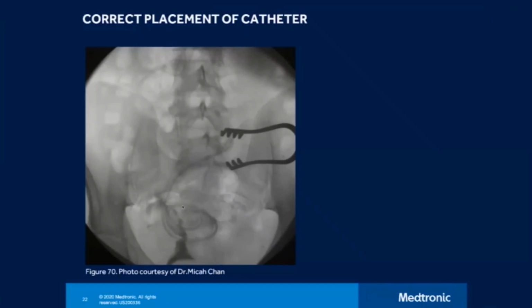So yeah, that's important too. Say a person has recurrent infections, Pseudomonas peritonitis, fungal peritonitis, or they're just going to get a transplant, or they're going to hemodialysis. You do need to remove the catheter. And again, to remove the catheter, you can't just pull it out. So you do have to make an incision. And if you placed that catheter, you know exactly where that incision is. So you make the same incision.